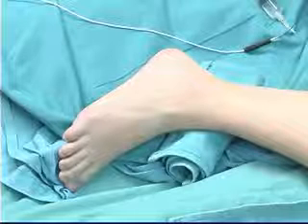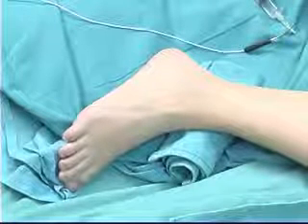Injection of local anesthetic agent or normal saline will cause the muscle twitches to stop immediately.